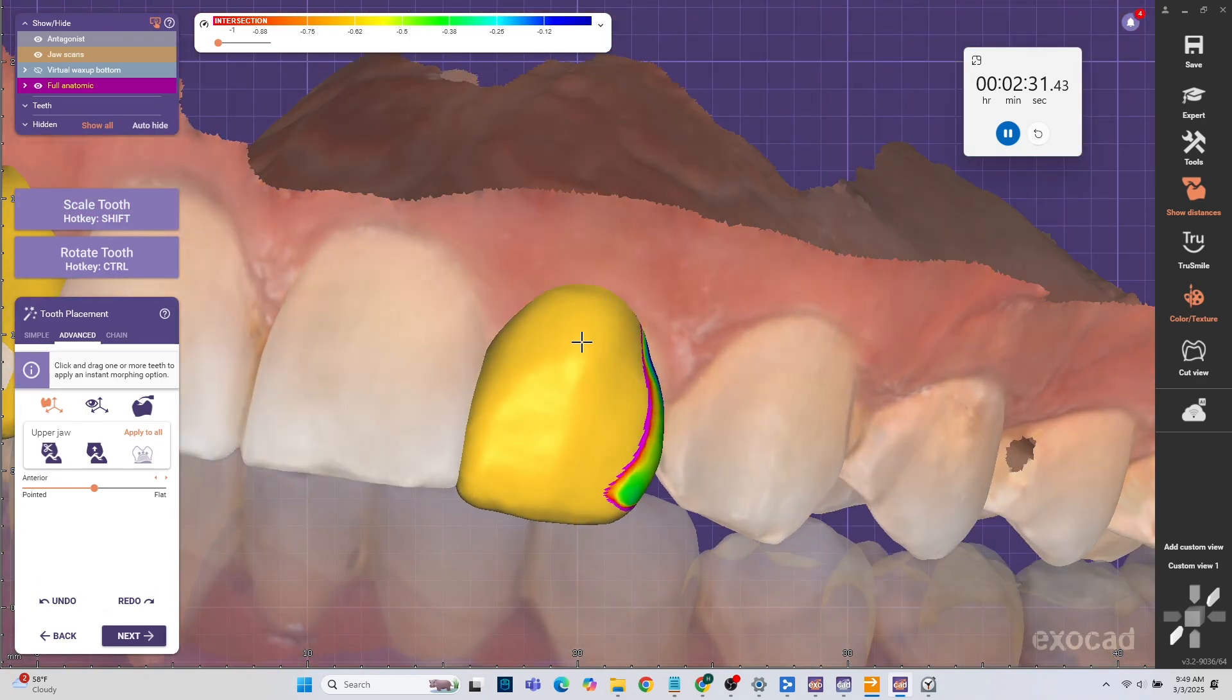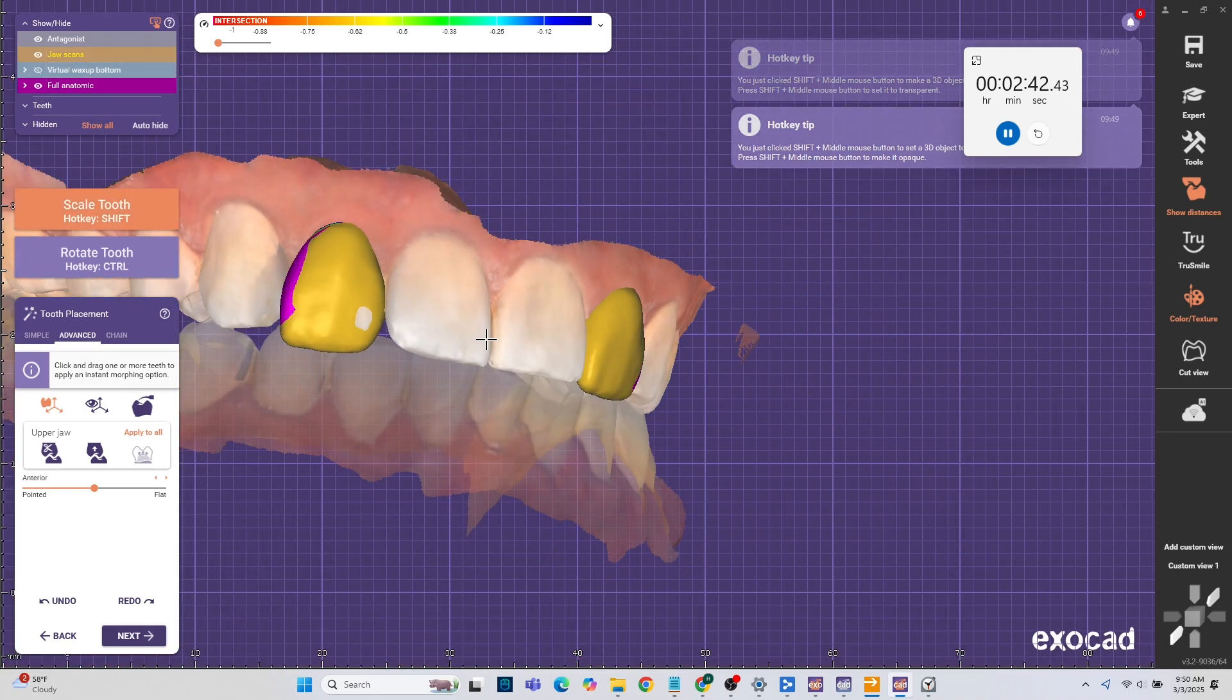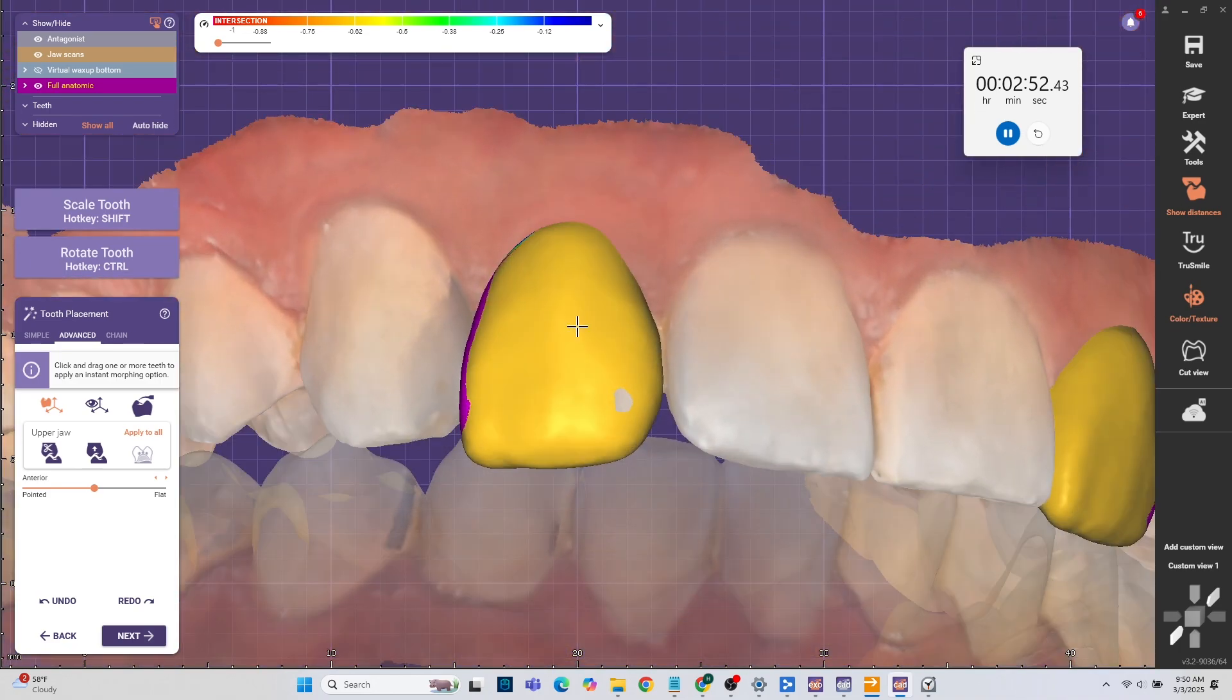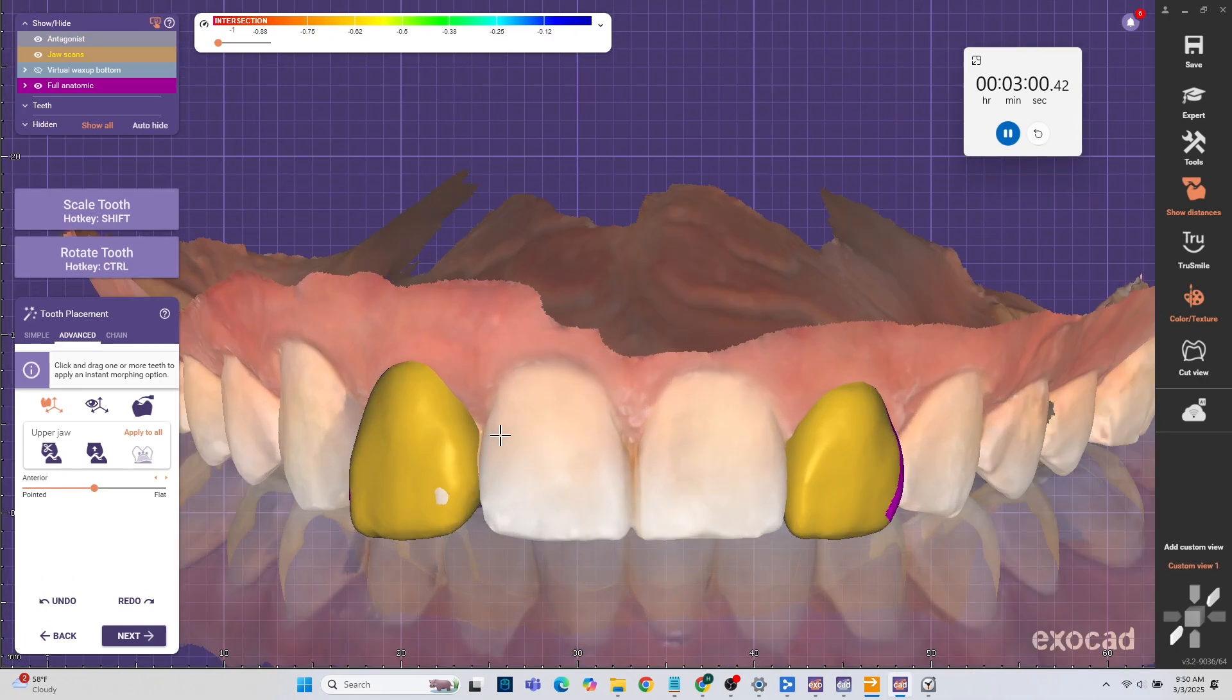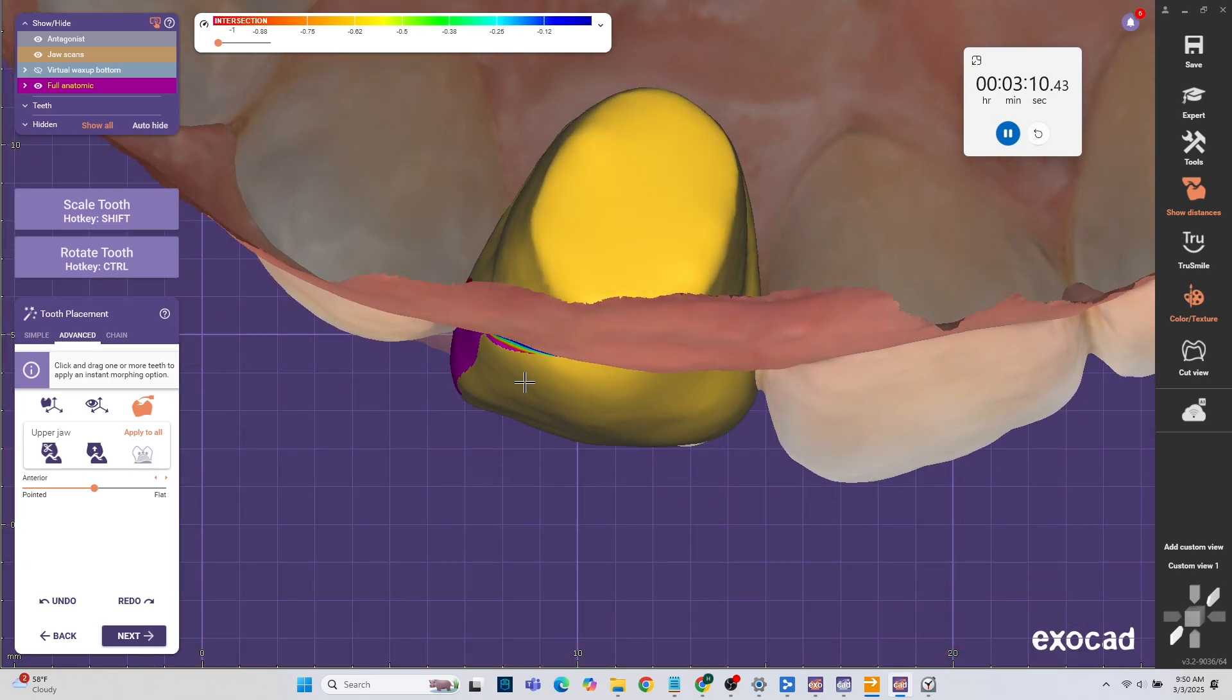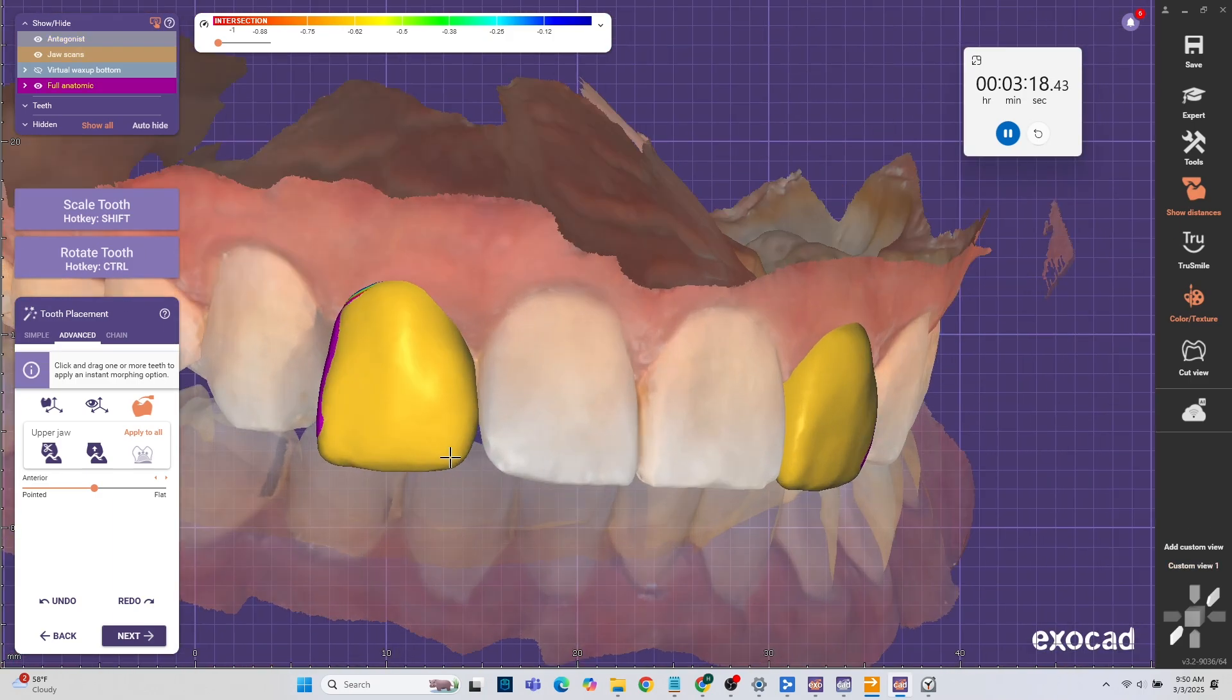Right now what I'm doing is basically I'm just planning out how I want the gingiva to look. Now this is an easy way we can do it. There's a little bit more fancier way to do it but it involves a little bit more work including a CBCT or an actual bone segmentation. That way you can actually plan it out perfectly. But if the doctor has already said oh we want to do two millimeter gingival reduction, well this is the way to do it. So right now I'm just setting up the teeth so I can have a beautiful gingiva.